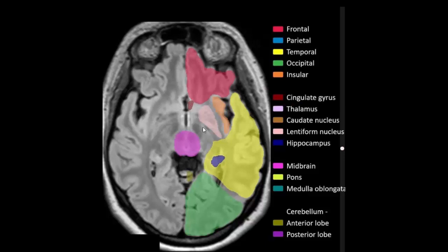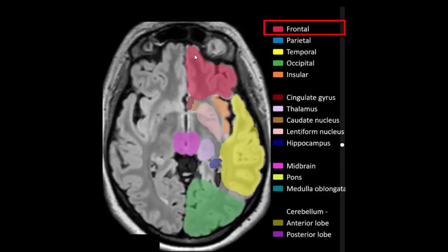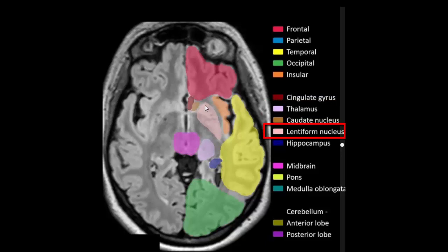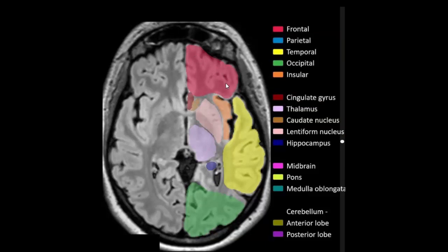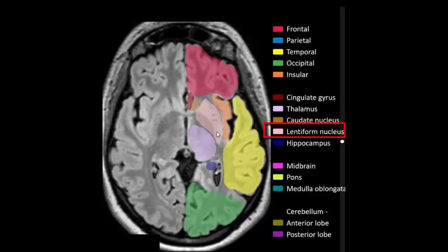Cerebellum. Occipital lobe, midbrain, hippocampus, thalamus, lentiform nucleus, insular cortex, head of caudate nucleus, cingulate gyrus. Cingulate gyrus, cerebellum, head of caudate nucleus.